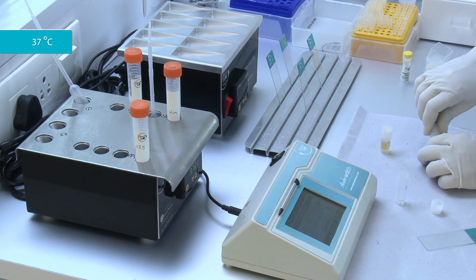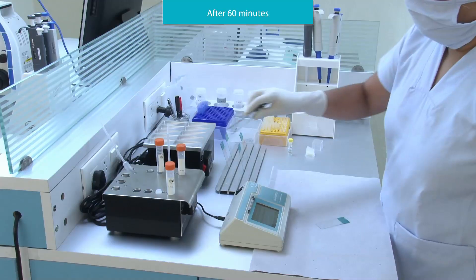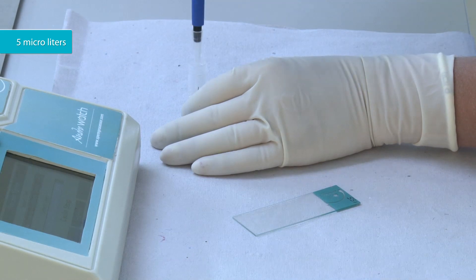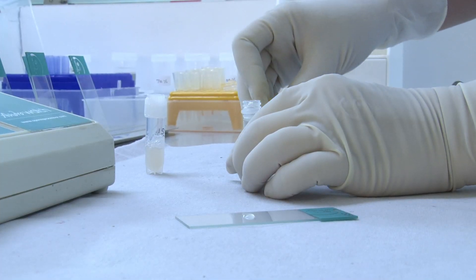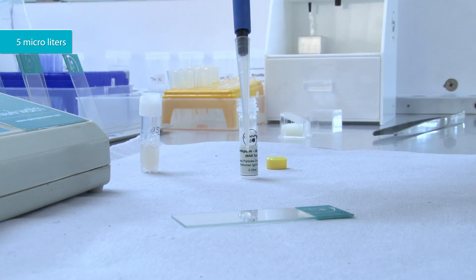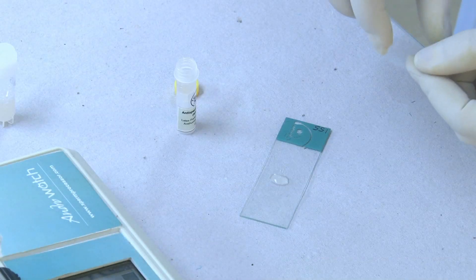Incubate the tube at 37 degrees Celsius for 60 minutes. Take a slide and label it with an ID. Place 5 microliters of incubated semen on the slide. Add 5 microliters of latex particles coated with anti-human immunoglobulin A antibody on the same slide. Put a cover slip on the slide.